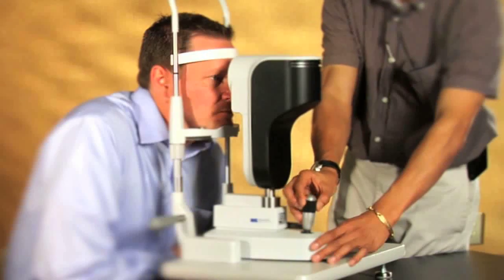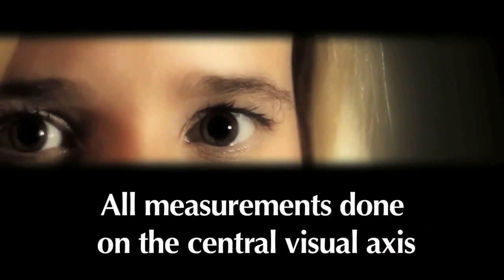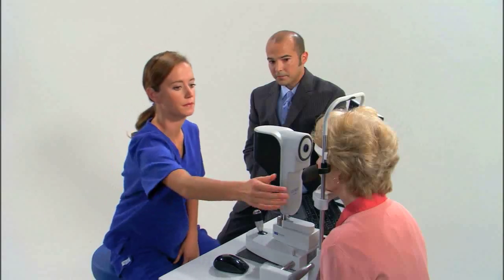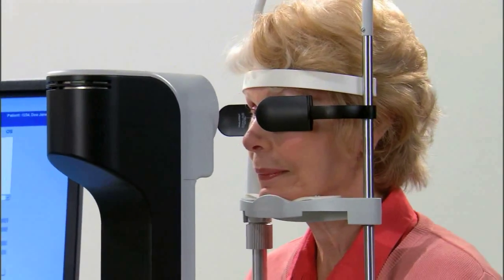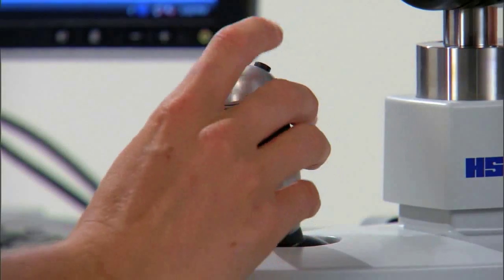LenStar provides the precision you and your patients need through advanced optical biometry. LenStar is distinguishable in that axial length is always measured on the central visual axis — a key element that enables immense enhancement in precision and repeatability. Automatic fixation control in LenStar also ensures that measurements are consistently repeatable.